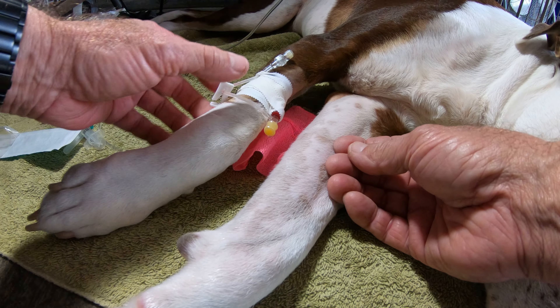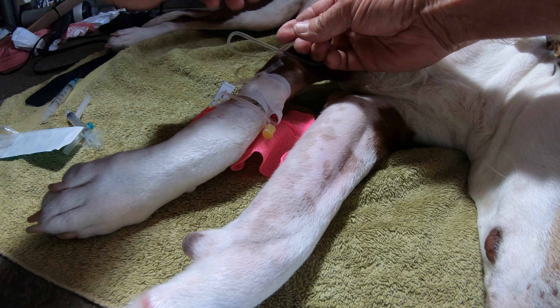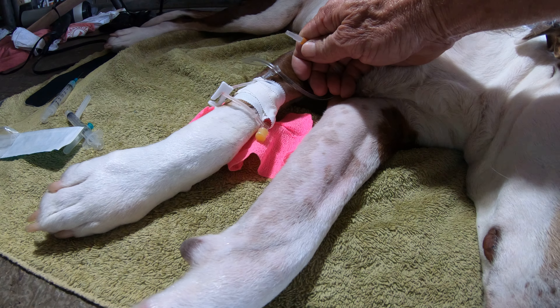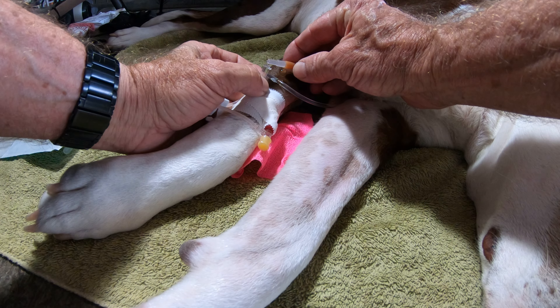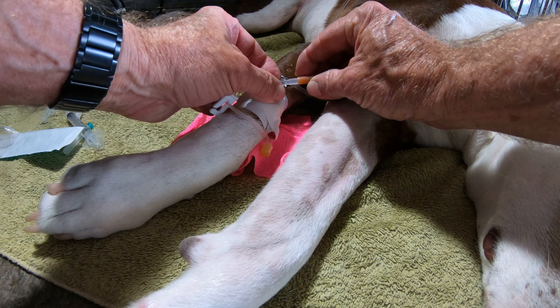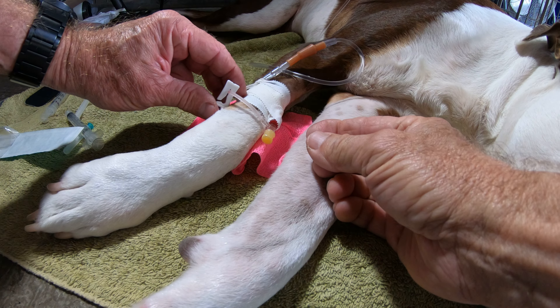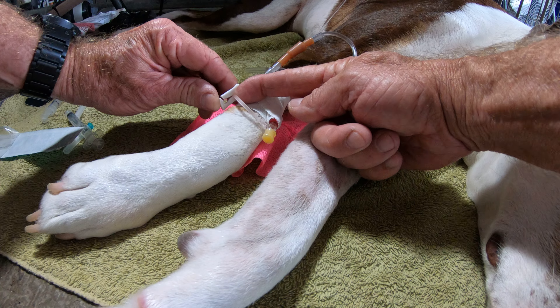I'm going to take this IV line and take off the cap from the catheter feed line. I'm going to start a slight drip on the IV line. I've got fluid coming out and I'm going to make sure there's no air bubble, so I'll overload this catheter port — no air in there now, it's safe. I've got the IV line dripping actively, so I'm going to open this clip so that the lactated Ringer's can start flowing into my dog.